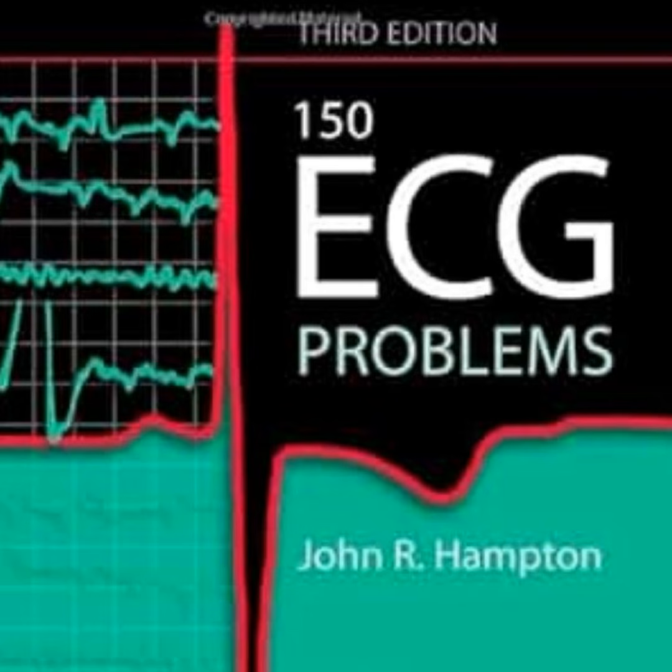It is. So for the learners trying to visualize this, can you walk us through the actual mechanics of that left axis deviation in the LBBB? Like, how does the vector of electricity actually physically shift in this patient's chest? Yeah, so to understand the shift, we first have to look at normal conduction. Typically, that electrical impulse travels rapidly down both the right and left bundle branches at the exact same time. Simultaneously, right? Right. And because the bulk of the heart's muscle mass is in the left ventricle, the dominant mean electrical vector points downward and to the patient's left.